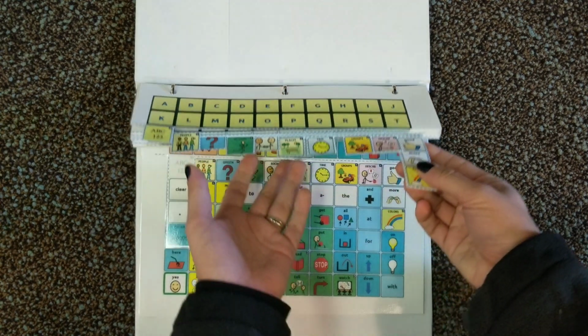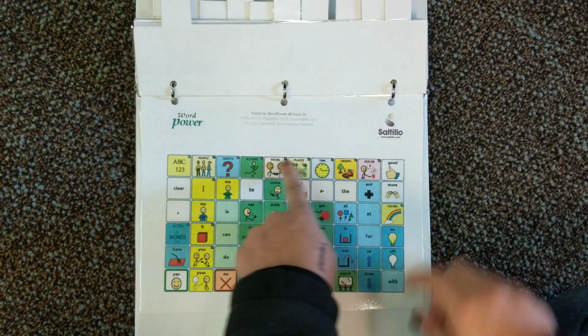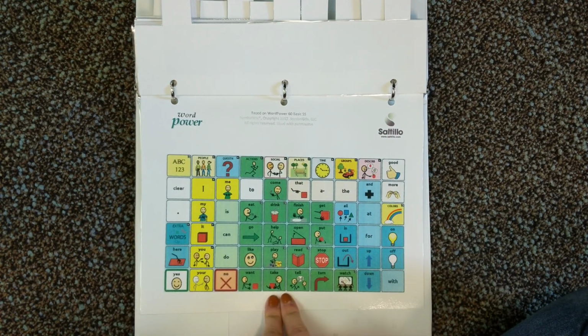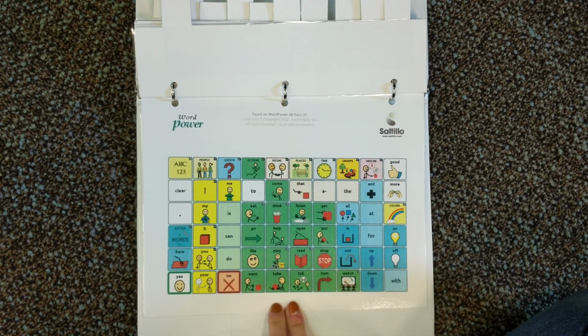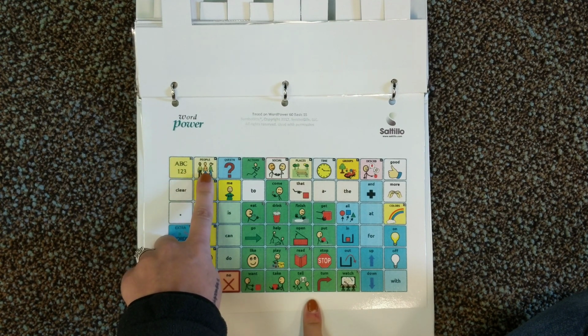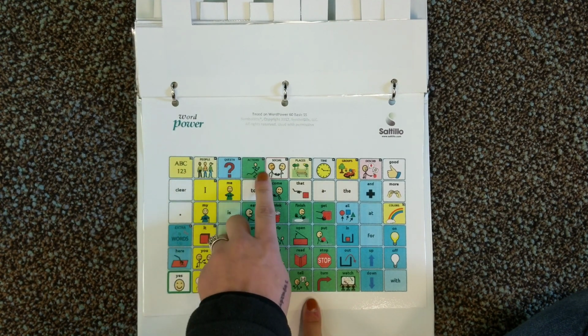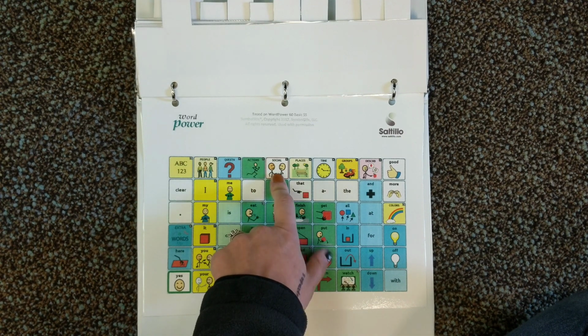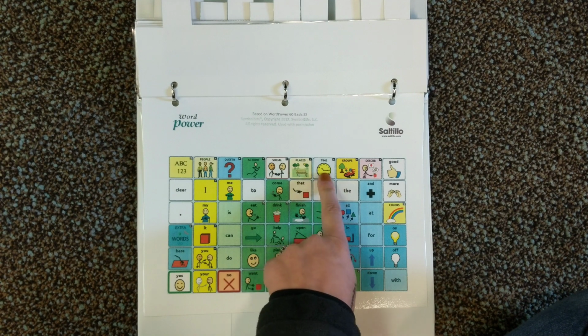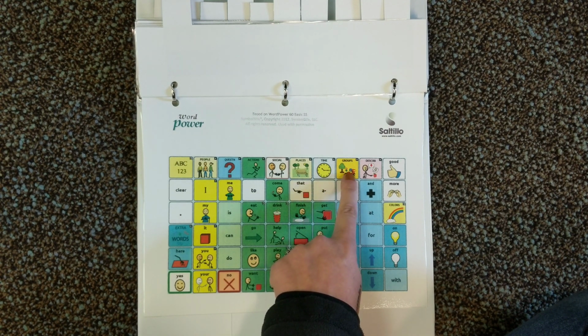So basically, this is what the home page looks like, and this would be what would be on the home page of the iPad and the app. There's different things across the top. There's a keyboard, there's a people page, a question page, actions, social language, a page about places, time, so this would be months, days of the week, seasons, groups.